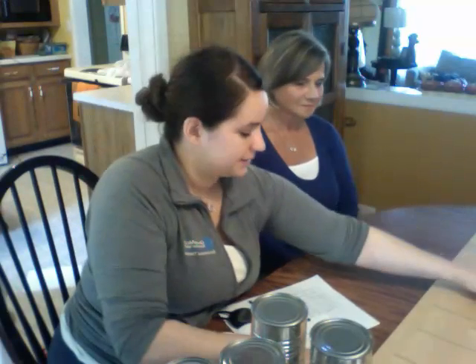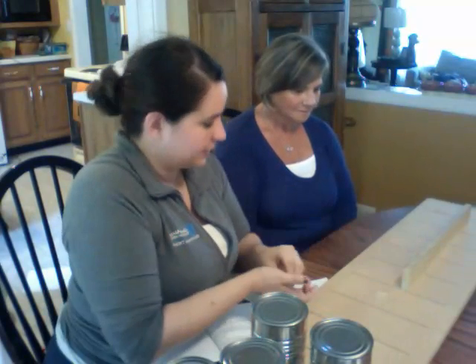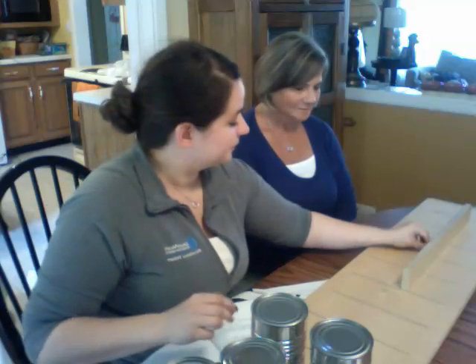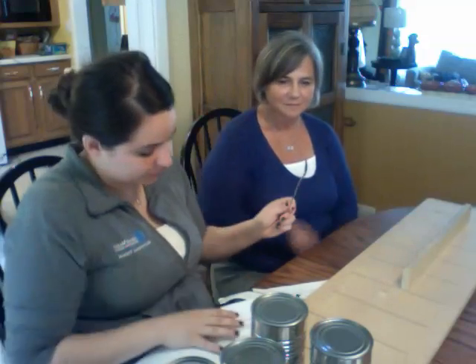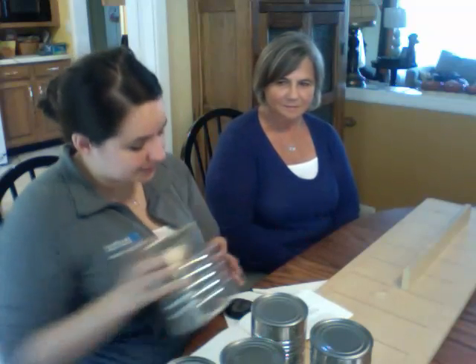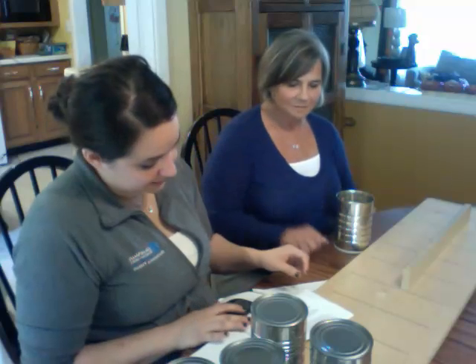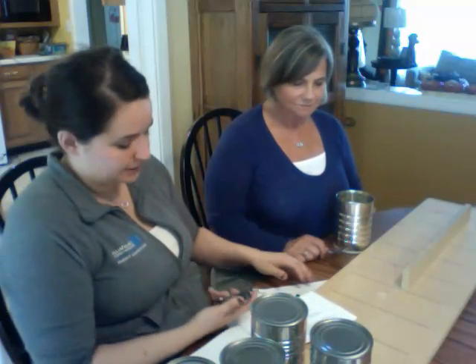All right, so our next subtest is we are going to pick up beans, and I'm going to place this board about 5 inches in front of you. You probably don't care how many inches it is. All right. And I'm going to hand you this teaspoon with your left hand, your non-dominant hand, and use your left hand to pick up these beans one at a time with the teaspoon, and then place them in the can as fast as you can, beginning with this one. Do you understand? Yes. All right, ready? Go.